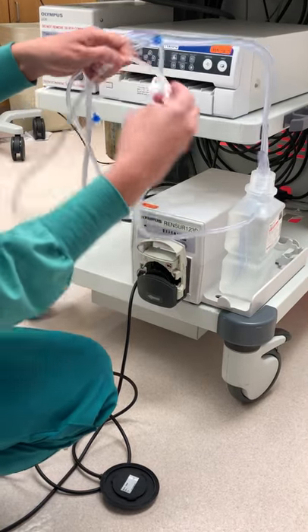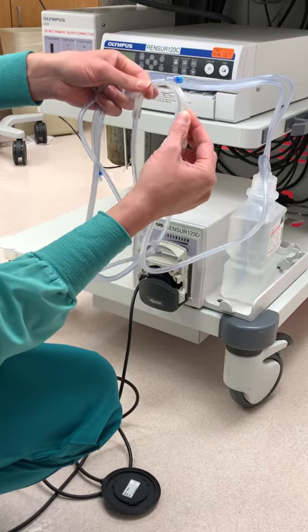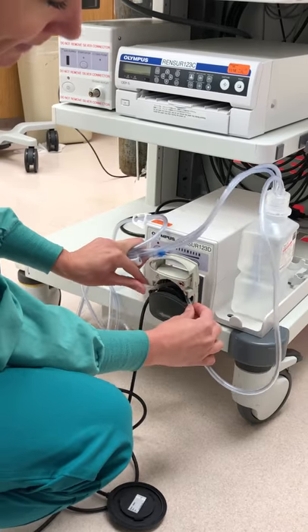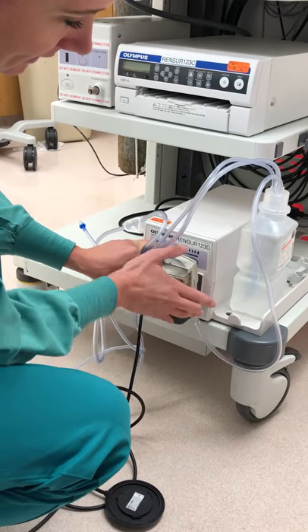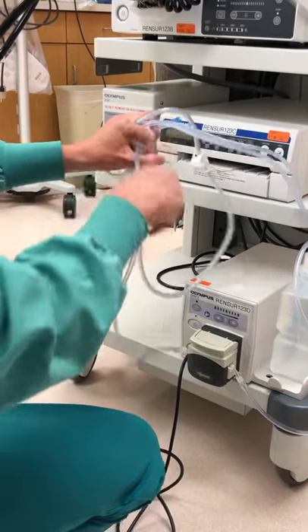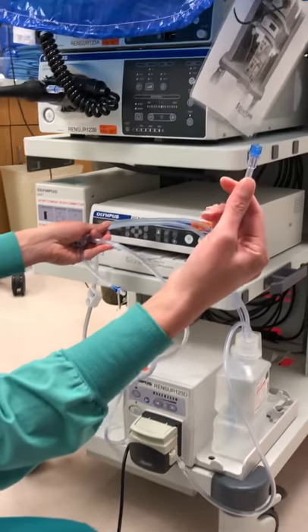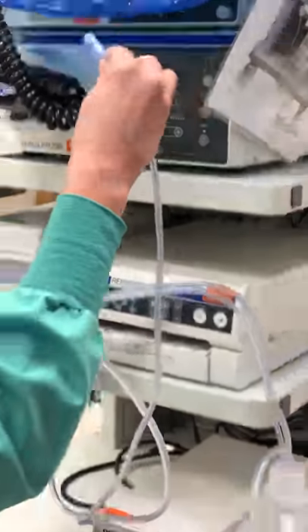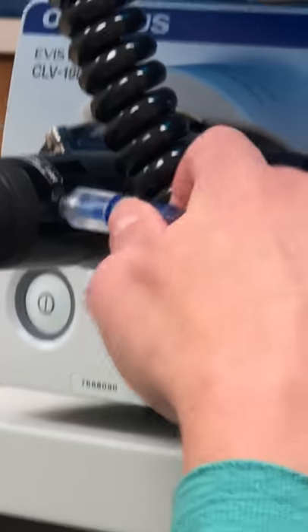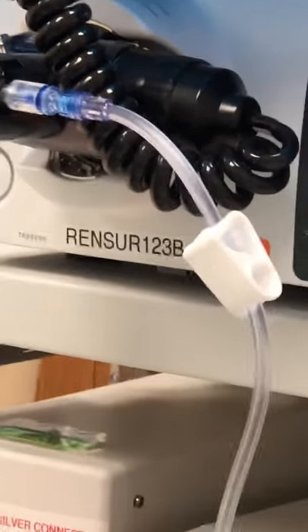Within this tubing there is a piece made of a different rubber — it's more pliable. That's the part that actually goes into the pump. Follow that tube up; this is the piece that you're actually going to put on that valve that you already put on. So there's one cord, two more to go.